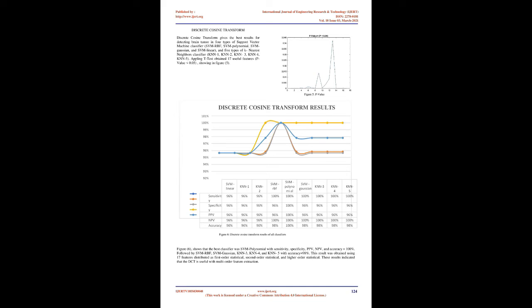These datasets were categorized into 72 normal and 72 abnormal, in which 98 ROIs were used for learning and 46 ROIs for testing. Pre-processing. We manually cropped a region of interest, ROI, with a size of 32 by 32 pixels to concentrate our work mainly on the damaged area for further processing.